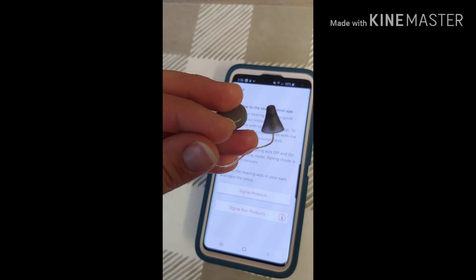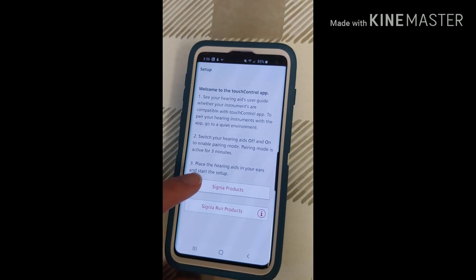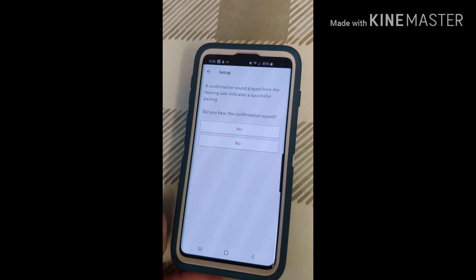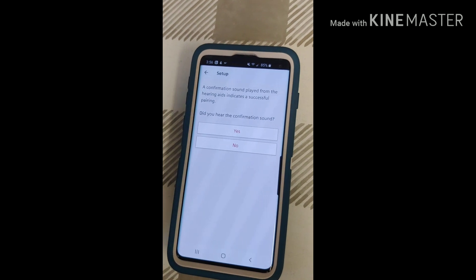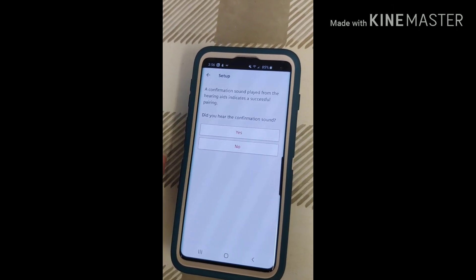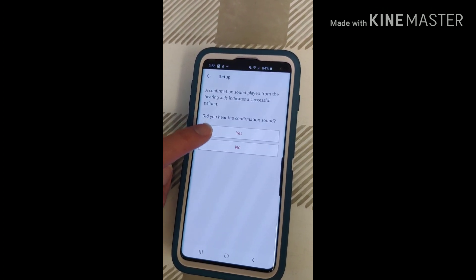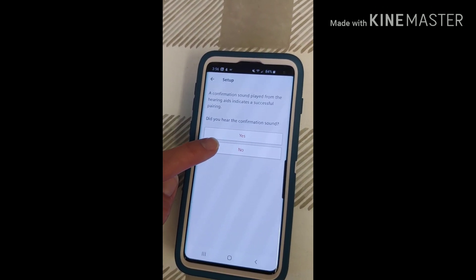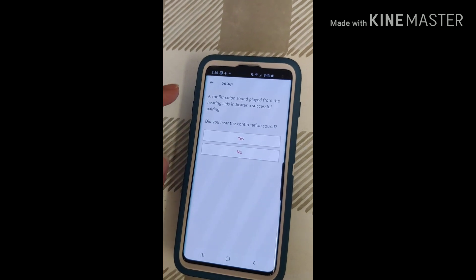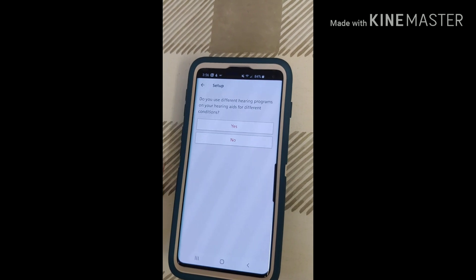Then you'll want to go ahead and put it back in your ear. Once it's back in your ear, you're going to hit Signia Products. It's going to ask if you heard a confirmation sound in your hearing aids, which will indicate a successful pairing. If you heard it, hit Yes. If not, hit No and try the restart again to see if you hear it the second time. We're going to go ahead and hit Yes.